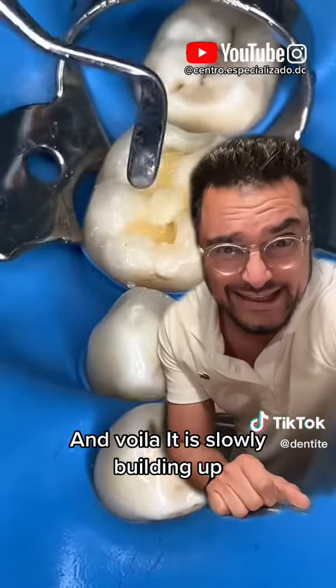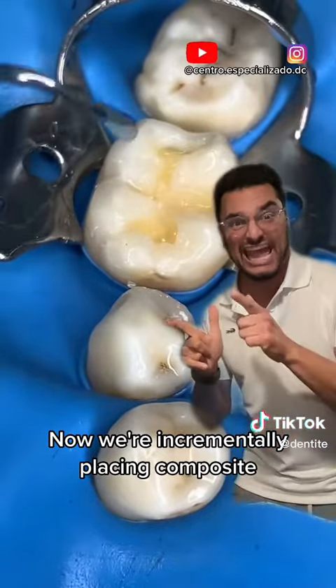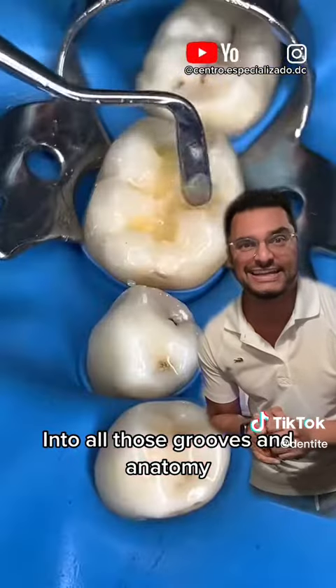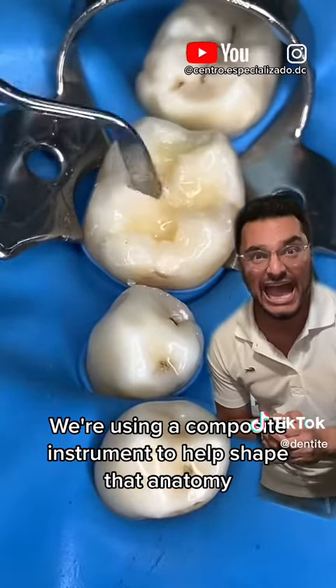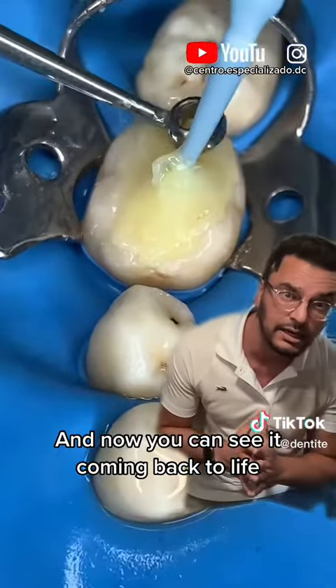And voila, it is slowly building up. Now we're incrementally placing composite — incrementally, that's the key here — into all those grooves and anatomy. We're using a composite instrument to help shape that anatomy, and now you can see it coming back to life.